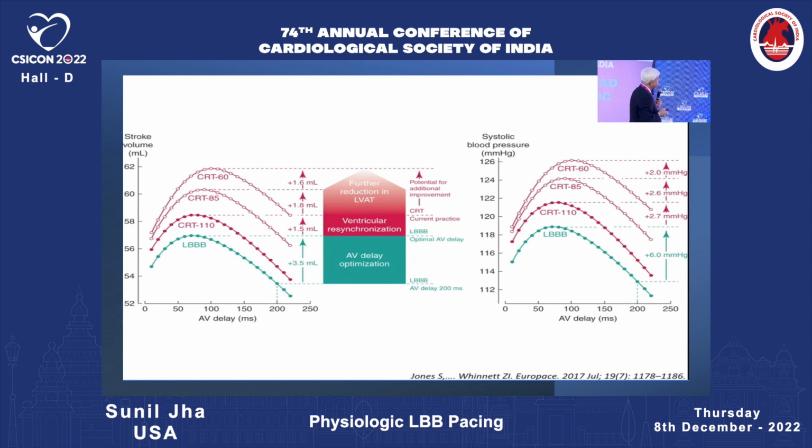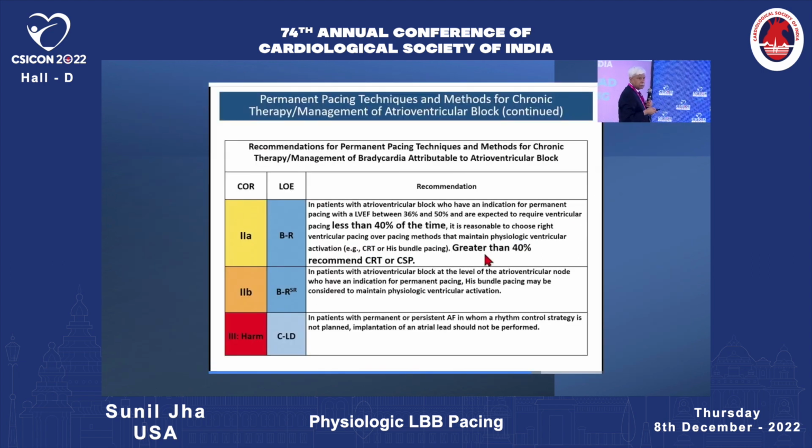This slide I like. With AV delay optimization, you increase the stroke volume and you increase the systolic blood pressure. When you have ventricular resynchronization, you improve them further. But there is still potential for additional improvement with left bundle branch area pacing. Dr. Jha, can we conclude soon?